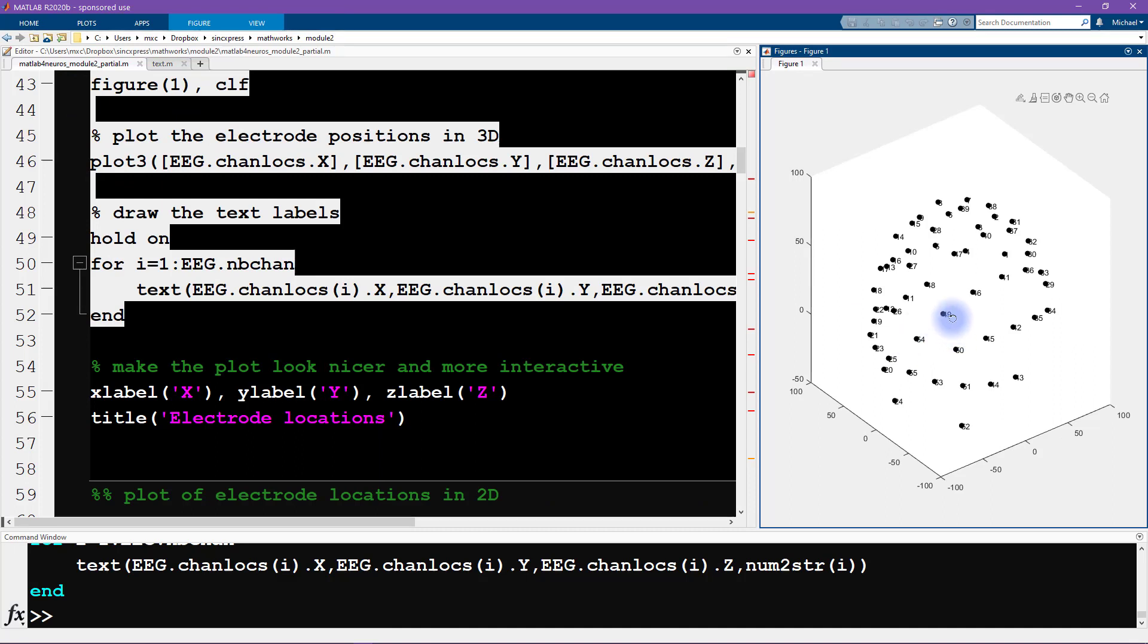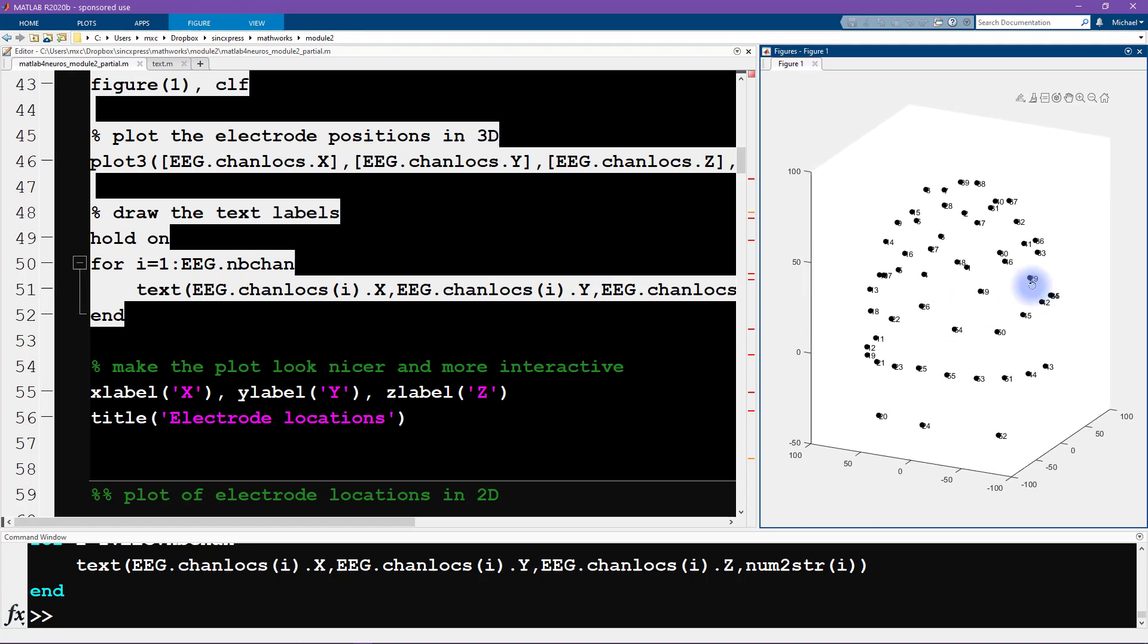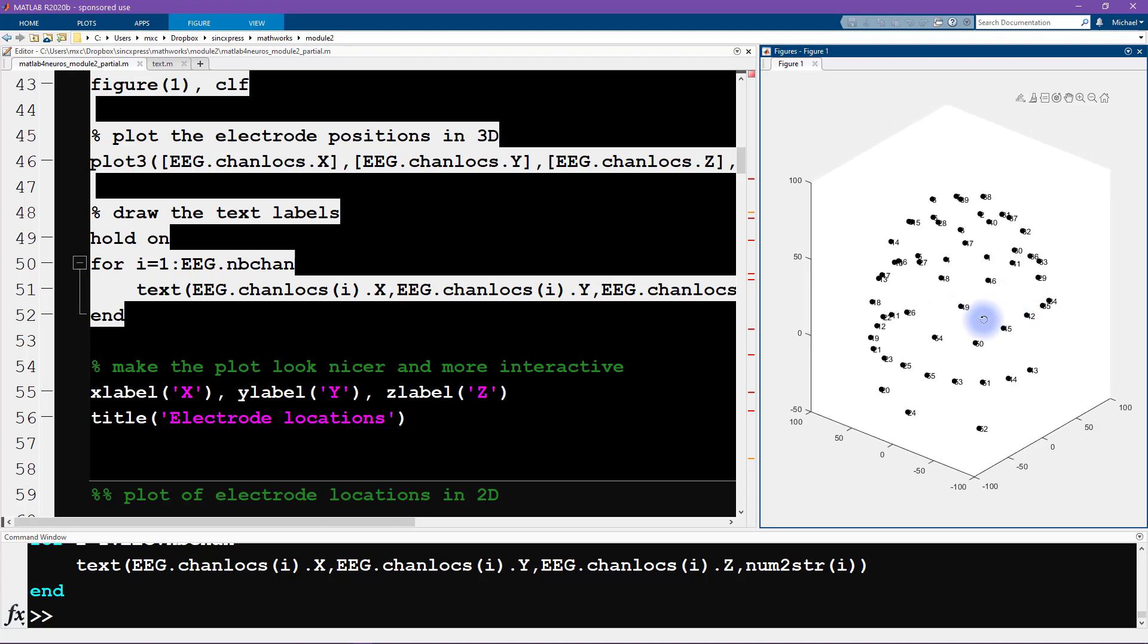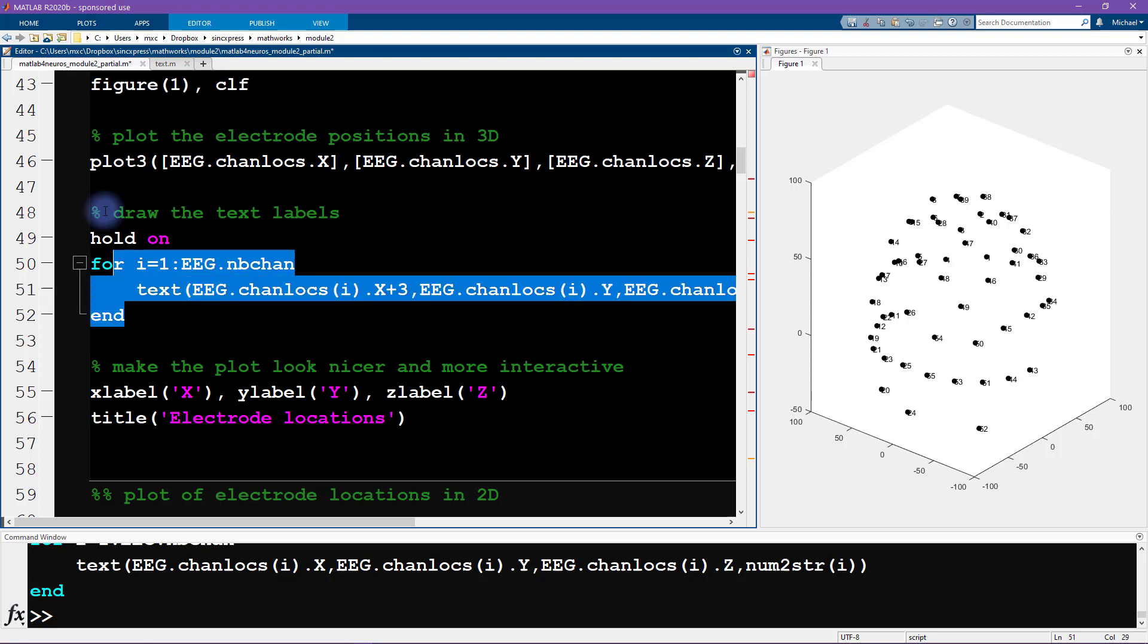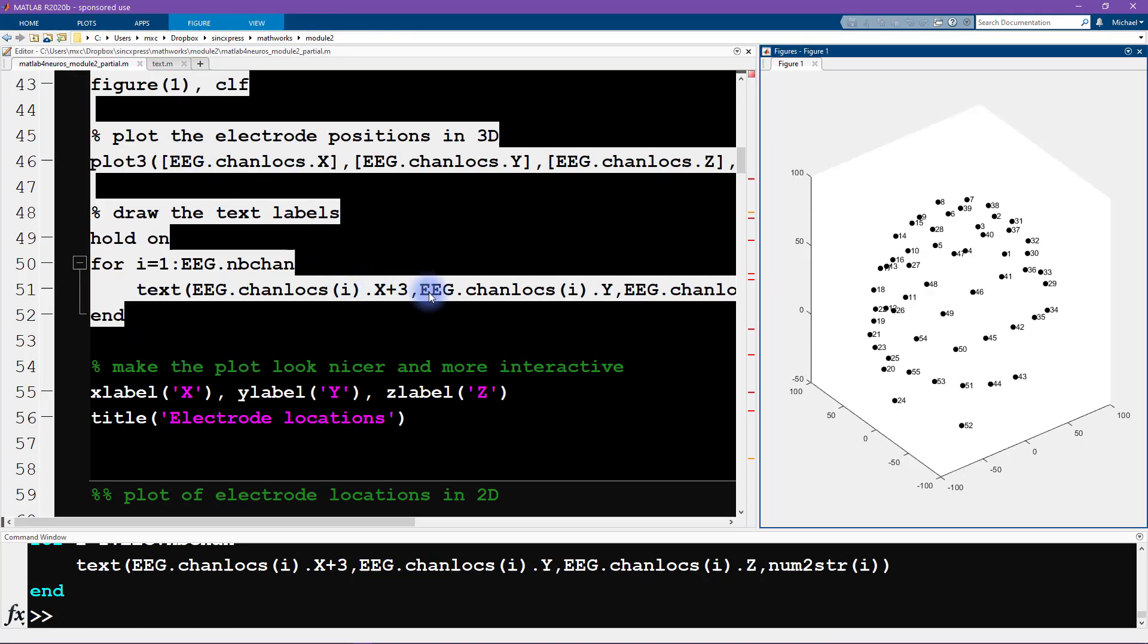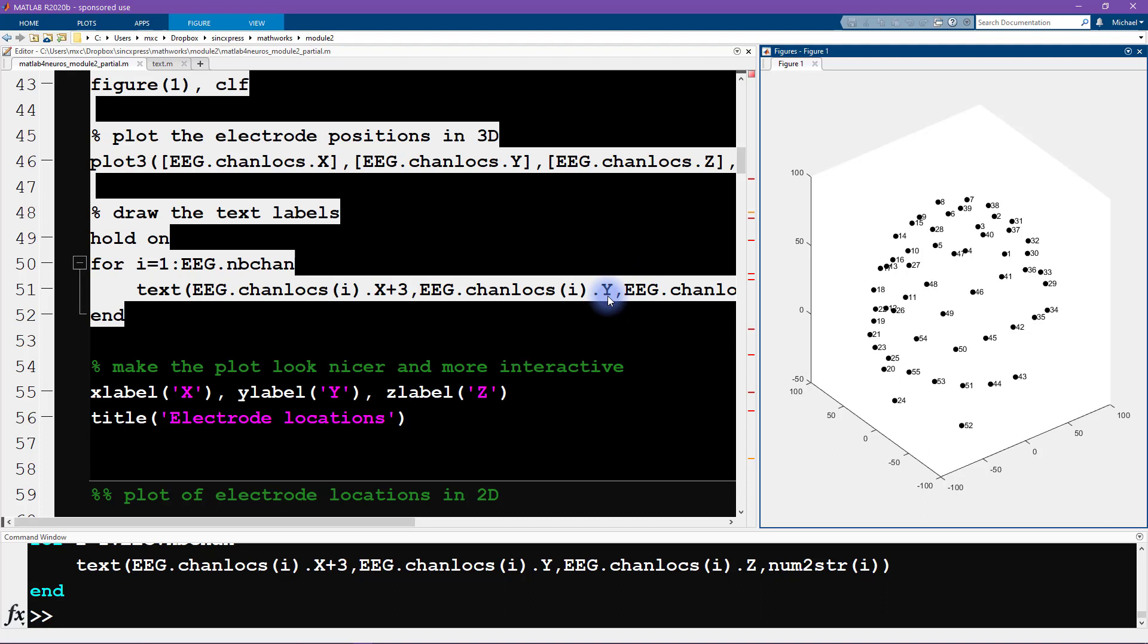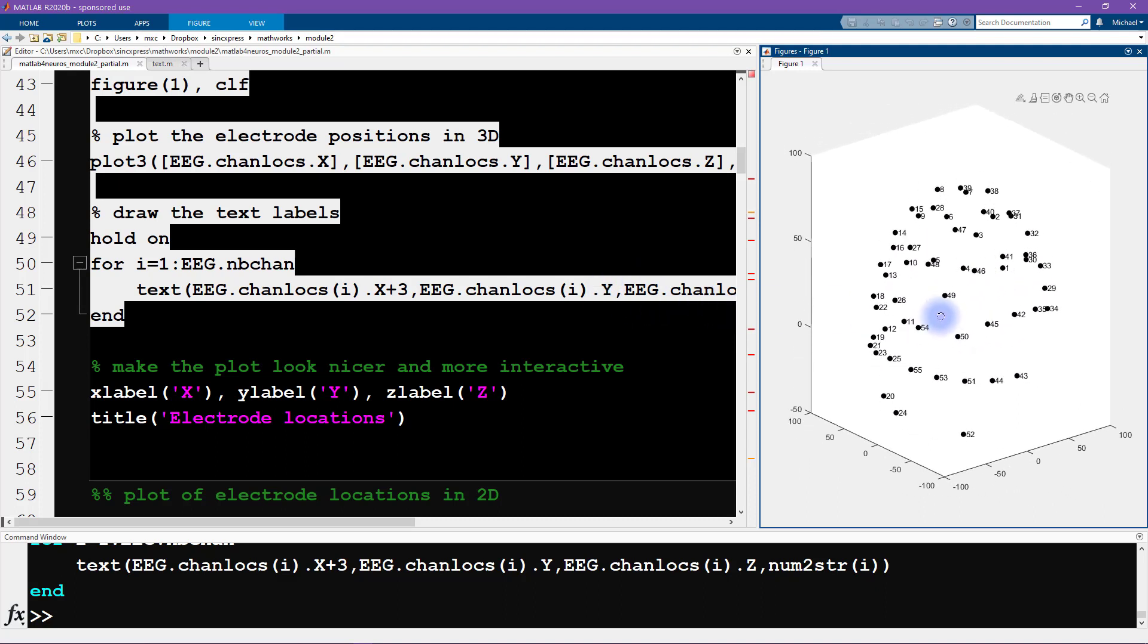Very good. Now, what you see here is that the numbers are partially overlapping with the dots. So that makes it a little bit hard to read. For example, this electrode here is this number 19 or 49, kind of hard to see. So what I'm going to do is add an offset to the x coordinates. I'm going to give an offset of three. Three is just an arbitrary number that I played around with a little bit. I found that this works pretty well. So you can see that provides a bit of an offset. You can also try offsetting the y or the z axes to see if you prefer that visualization.